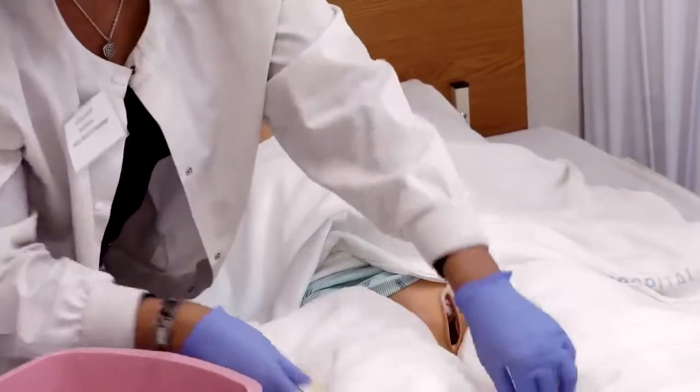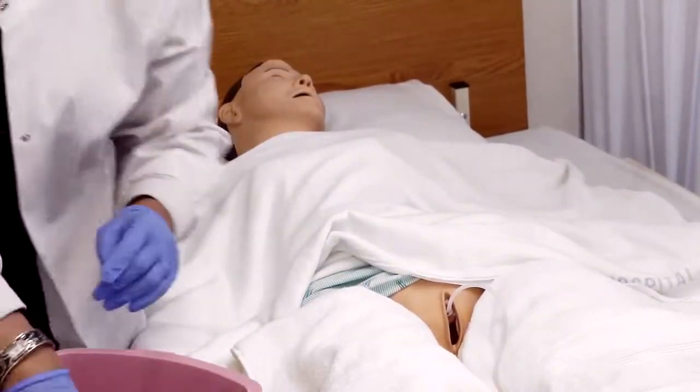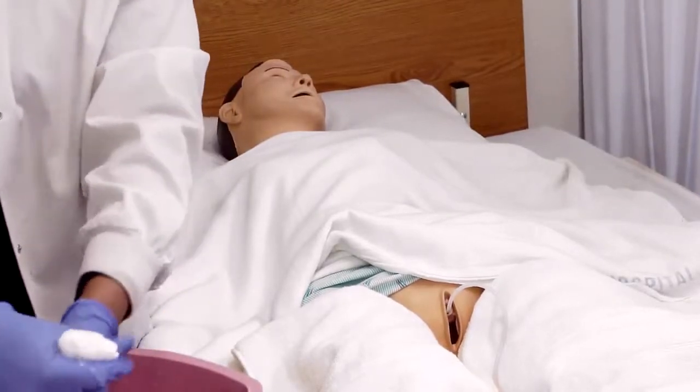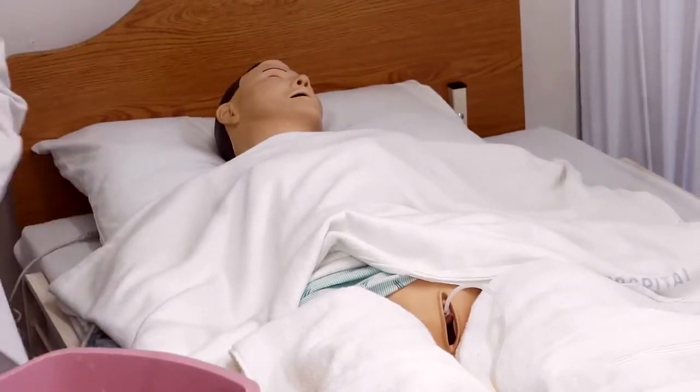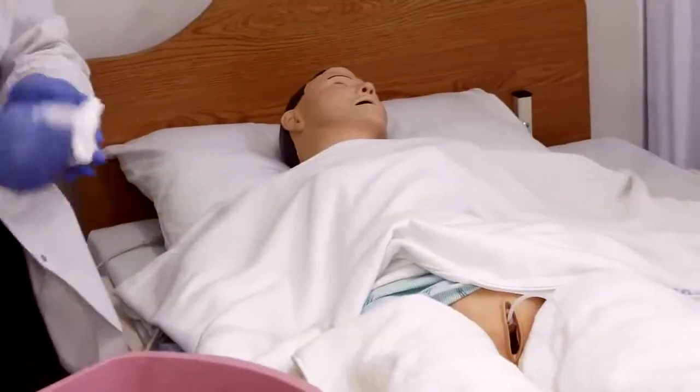Okay, so now we wash. Washcloth gets wet. Bring it out. Squeeze our soap on it. We don't want any soap in the water, so we lather away from the bucket.